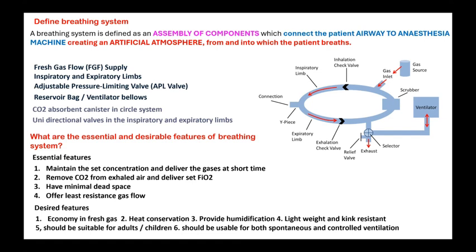It's for the peak. What is the tidal volume of an adult? It is about 500 ml. 500 ml. Then why do you require a 2 liter bag? You could as well have used the 500 ml bag that is used for pediatric patients for adults. So why are you using a 2 liter bag? Anybody else can also answer. Who knows the answer? Bindu or Randini? Anybody in the class can answer this question if they know the answer. Aravind.